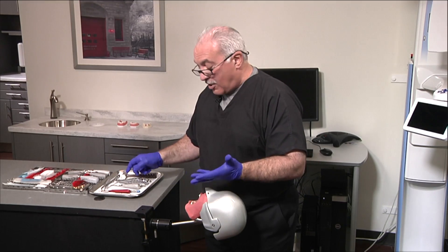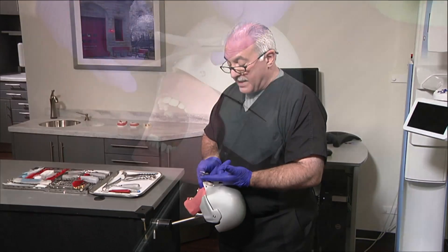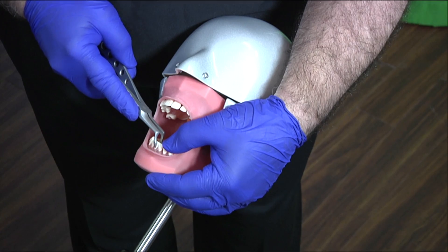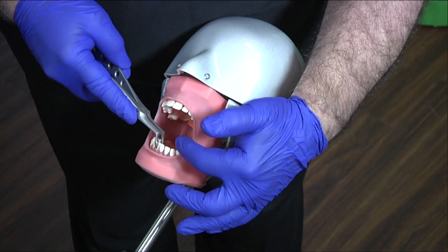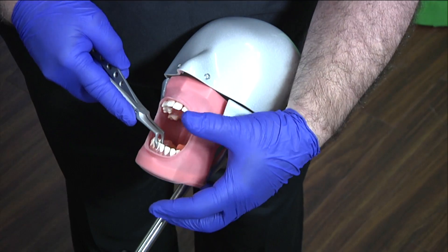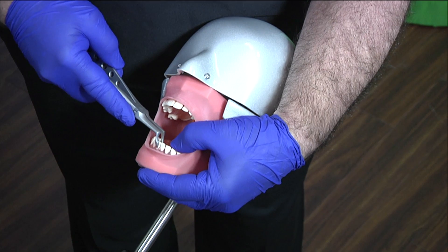For lower anteriors, I would have the patient move and adjust the chair. The steps would be the same, and I've routinely used the anatomic root forceps. I'm behind the patient — I'm ergonomic, I'm in balance, I'm in control. Place this and literally carefully unscrew, knowing that the roots of a lower incisor are not conical. Anytime I take a mandibular tooth out, if the patient will tolerate a bite block, I use it because we exert tremendous forces upon the TMJ complex and I want to protect that. The bite block's there, I'm retracting the tissue with my thumb, I'm supporting the mandible below, and I'm guiding this tooth out.